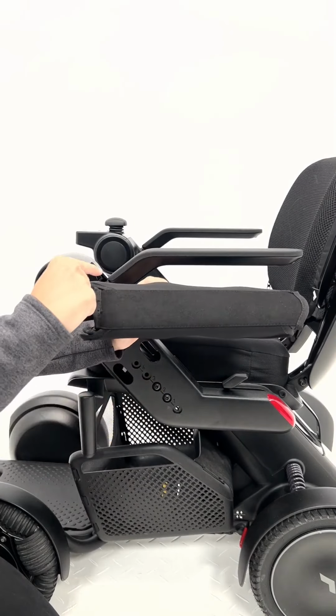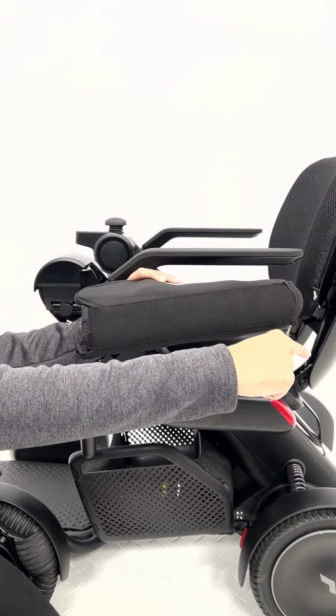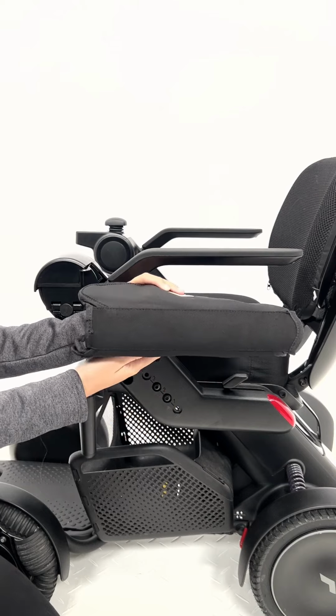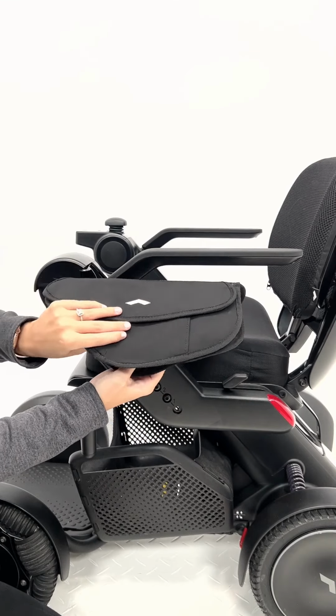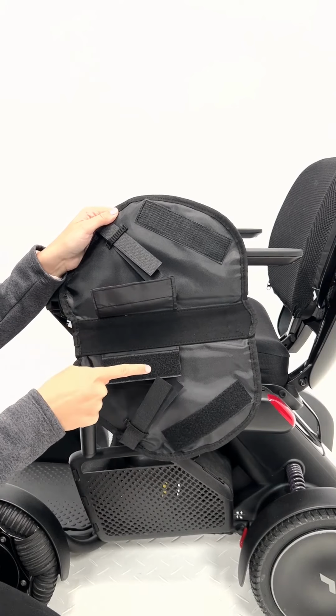Take a moment to determine the correct direction for the arm bag to be installed, placing the straight edge toward the front and the curved edge toward the back of the armrest. Open the sidearm bag and identify the Velcro straps and their corresponding attachment points.